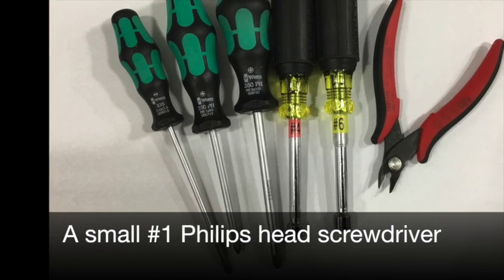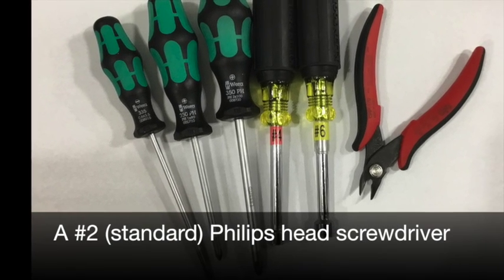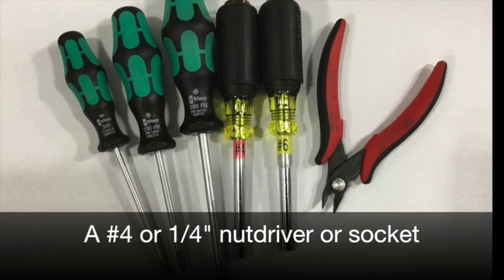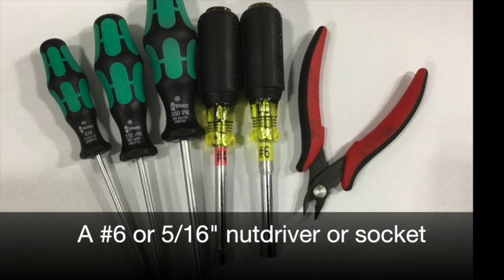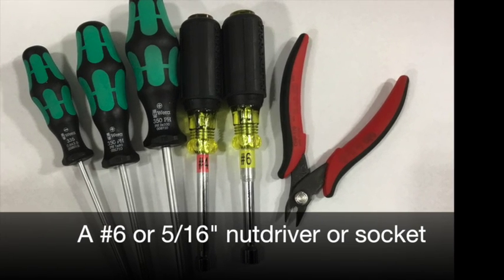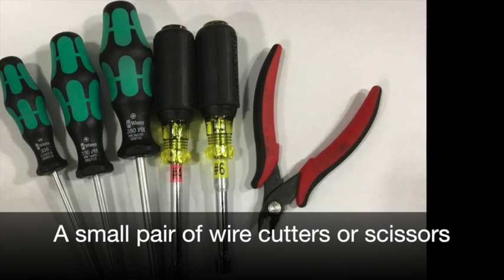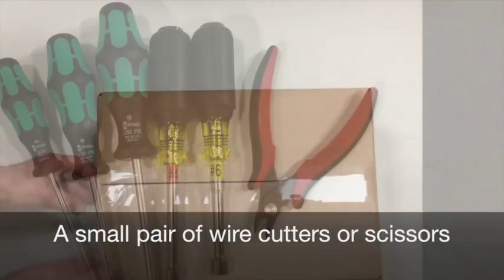Before we begin, you're going to need a small flathead screwdriver, a small Phillips head screwdriver, or number 1 Phillips head screwdriver, a number 2 or standard Phillips head screwdriver, a number 4 or 1/4 inch nut driver or socket, and a number 6 or 5/16 nut driver or socket. A pair of wire cutters is preferred, or you could use a small pair of scissors as well.